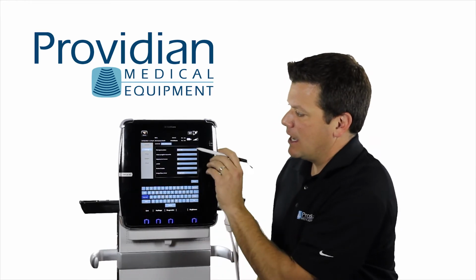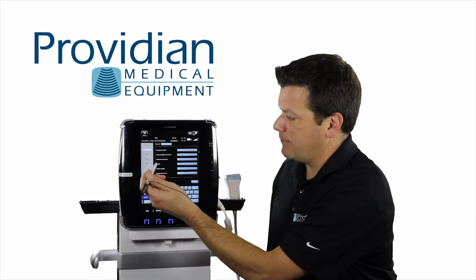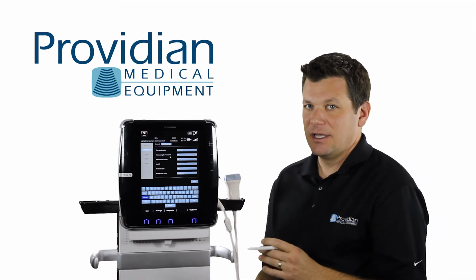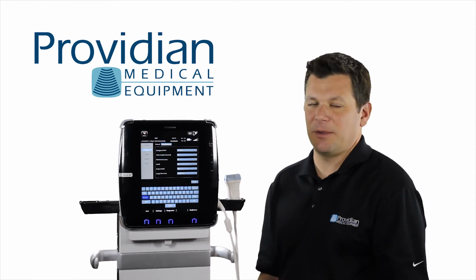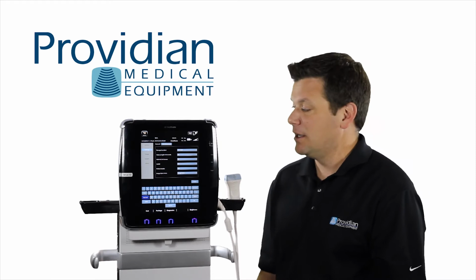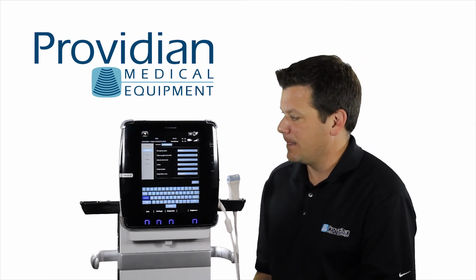Your settings, how do you want it stored? Do you want the SD card, USB, external hard drive? How long do you want to set the video length for your Cine? Now remember, if you're going to save Cine loops, you don't want to use too much. If you use 30 seconds, it's going to take up a lot of memory on your SD card. So you want the shortest time that you would normally be doing it. If you're not going to be saving long Cine clips, set it to a lower setting.